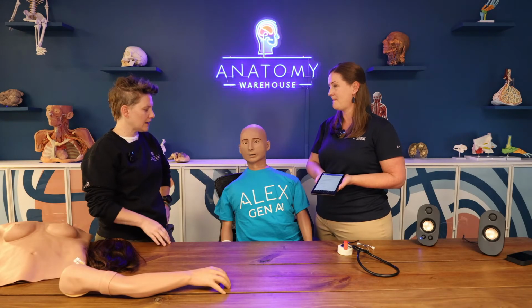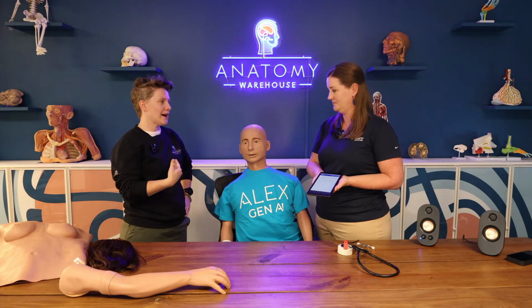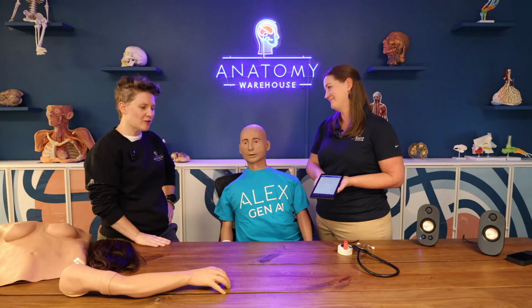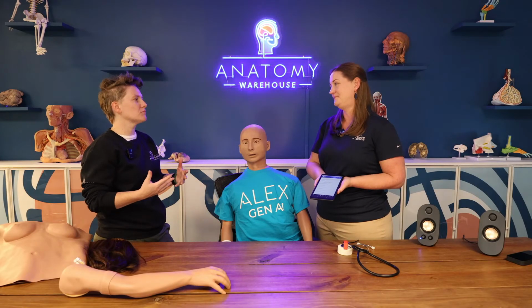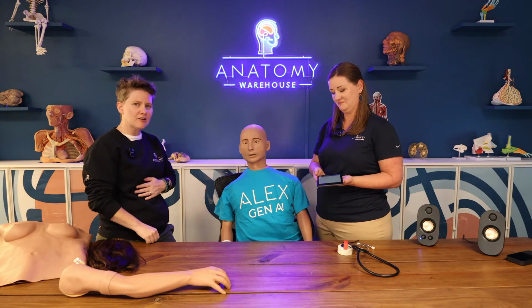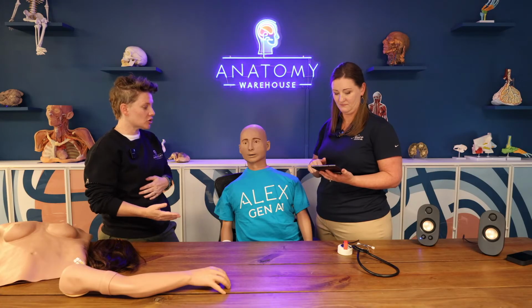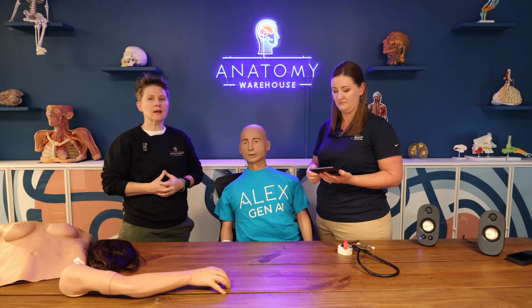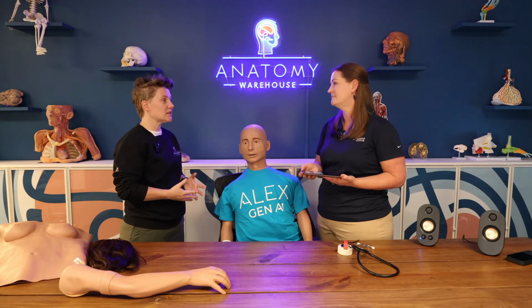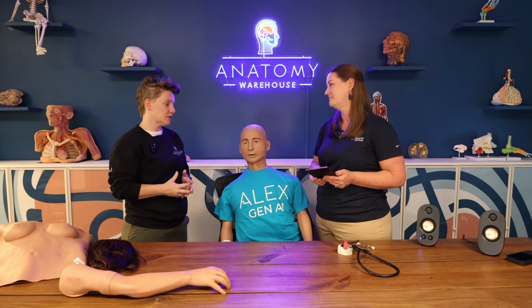And I think, again, with the ease of setup for the new scenarios, I know back in our early days, you would have to program so much into the mannequin. You'd have to write all these different scenarios out. And it's just so cool that you guys have leveraged the new technology coming out to make that so much easier for both the instructors and for the students. And it just keeps getting better.